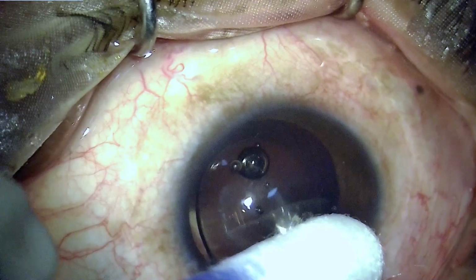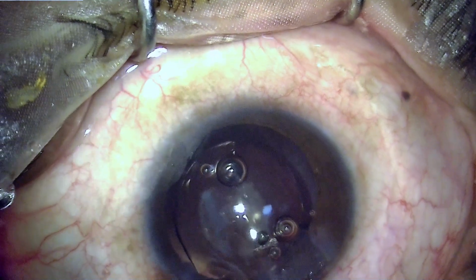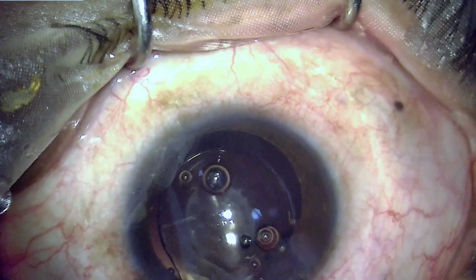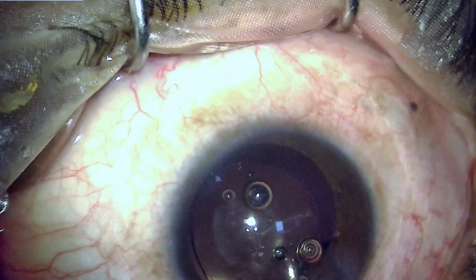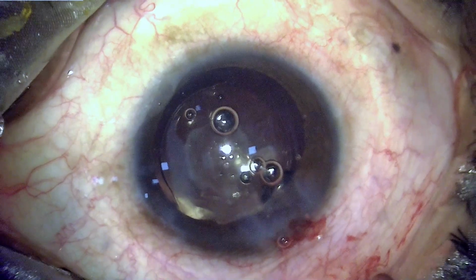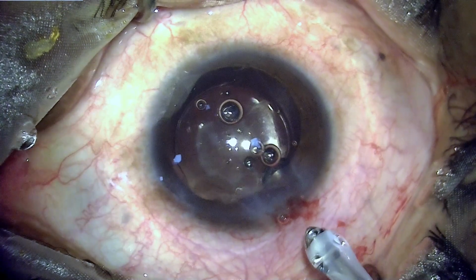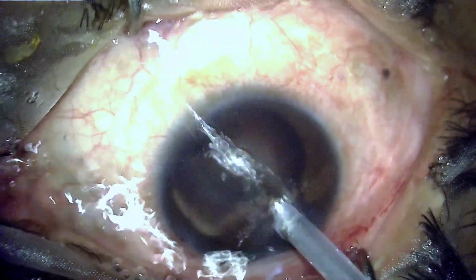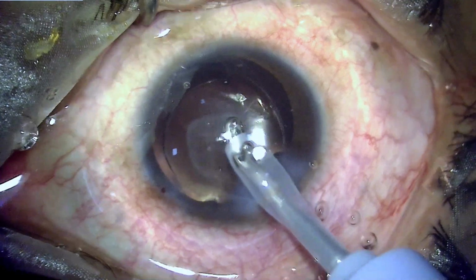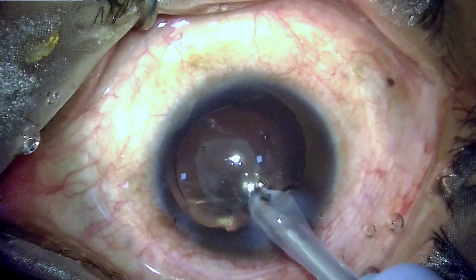Every time when I am exiting, I take care that there is no sudden collapse of the anterior chamber, and I use a swab stick to seal the main wound immediately after exit of an instrument. Now when the surgery has been nearly finished, we are simply there to remove the retained viscoelastic, washing away the viscoelastic using the routine irrigation aspiration technique using an irrigation aspiration cannula.